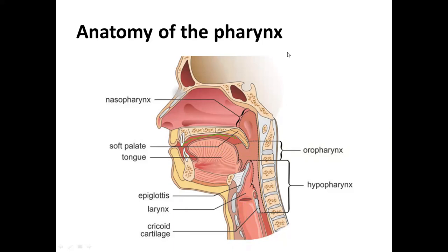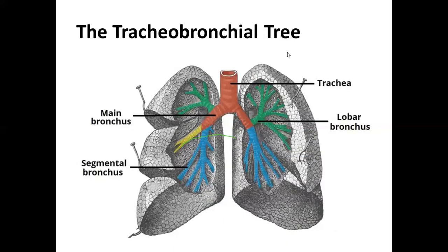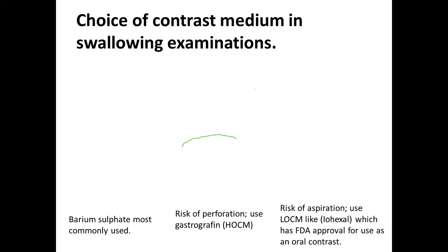So in this image, I just want us to appreciate the airway where contrast goes in the process of aspiration. This is the trachea, and the trachea has two branches of airways, which are the bronchi. This is the right main bronchus and this is the left main bronchus, branching at the carina, and these are bronchial trees going to the lobes.